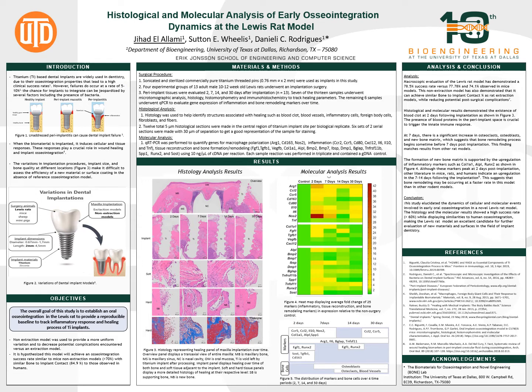So my work is concentrated on dental implants and their failure. As you can see in figure 1, we have a dental implant, and due to many factors such as bacteria or the trauma after the surgery, we may have a failure that can lead to peri-implantitis. This is like a late stage failure. We are targeting the early osseointegration, meaning we want to make that implant more susceptible to healing in a good way.